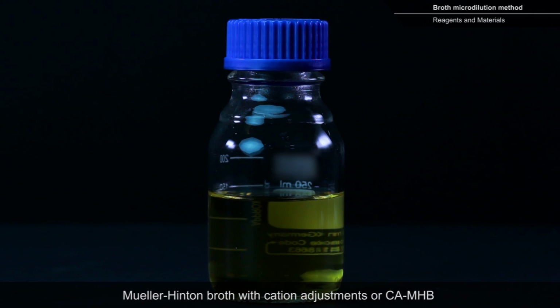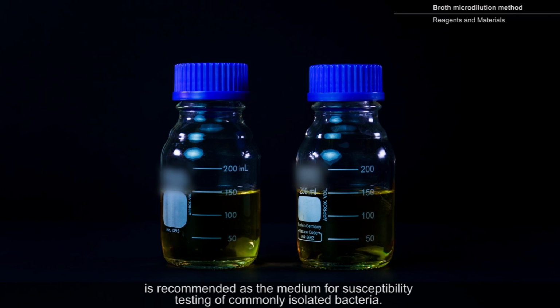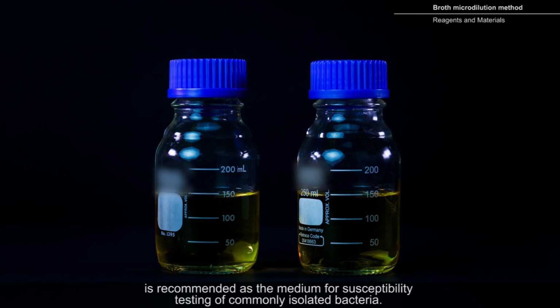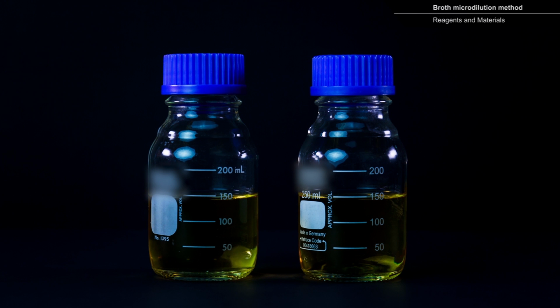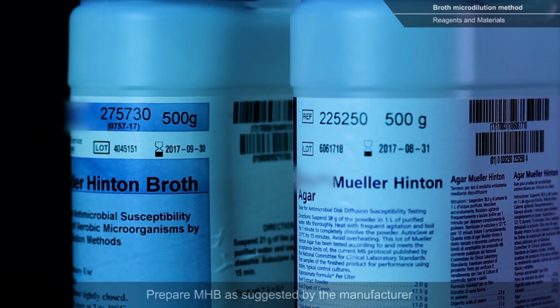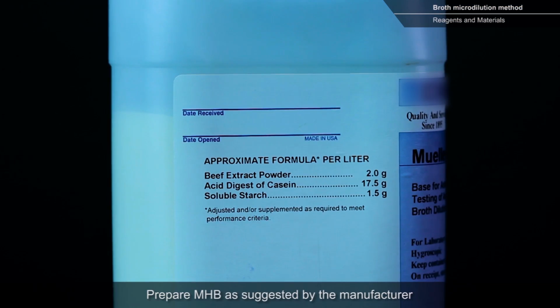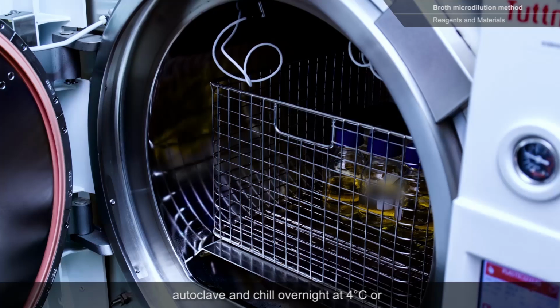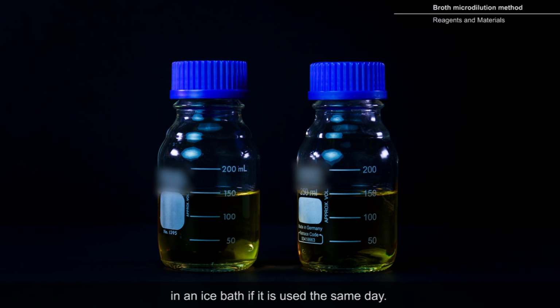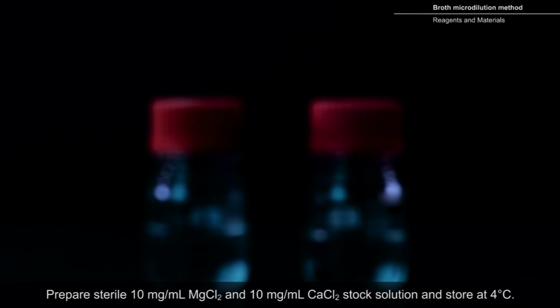Mueller-Hinton broth with cation adjustments, or CA-MHB, is recommended as the medium for susceptibility testing of commonly isolated bacteria. Prepare MHB as suggested by the manufacturer, autoclave, and chill overnight at 4 degrees Celsius, or in an ice bath if it is used the same day.